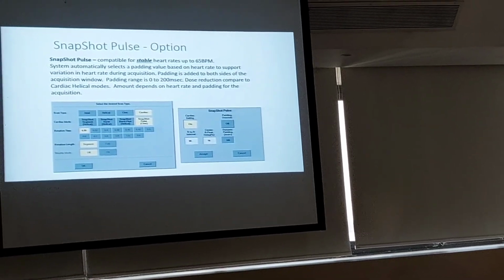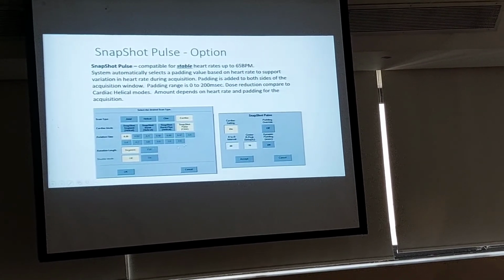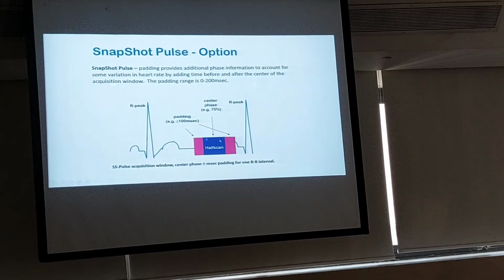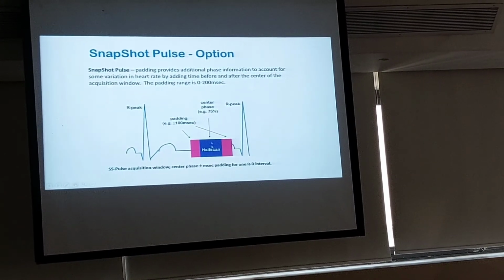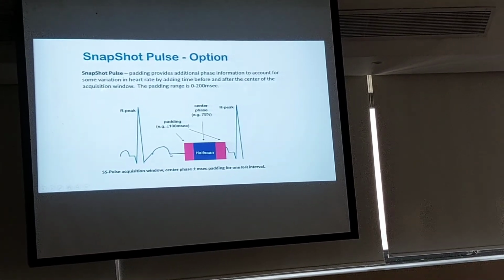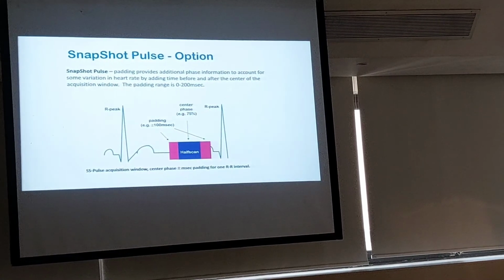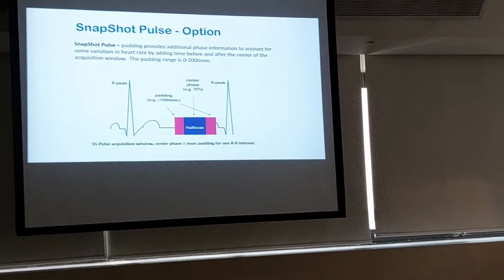Snapshot Pulse, this is the protocol. This is the cardiac gating, this is the rotation speed, the pulse. See, this is how it works. This is the total exposure, and we will use only these data to build an image, and these data are for padding. I may shift a little bit more or less so as to get proper stability of my still images.